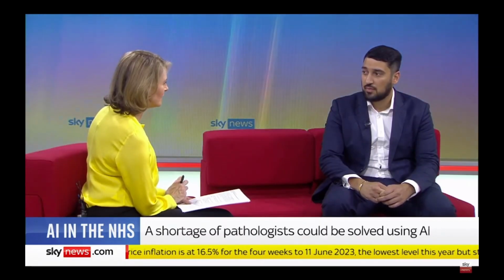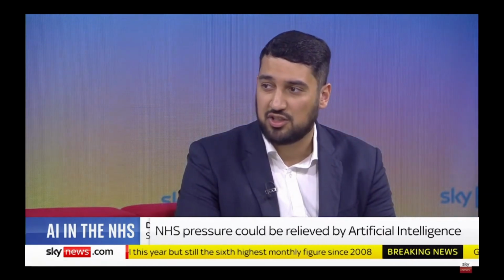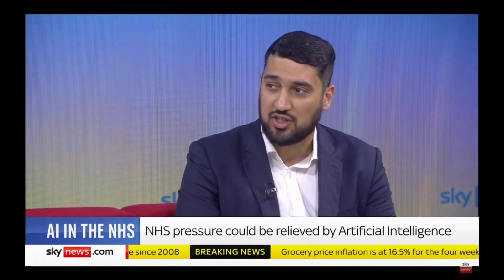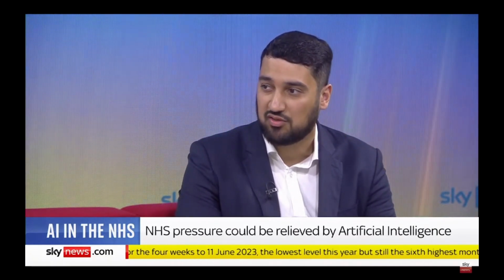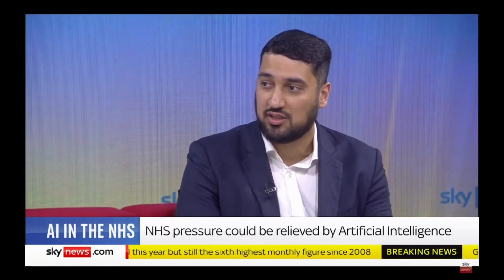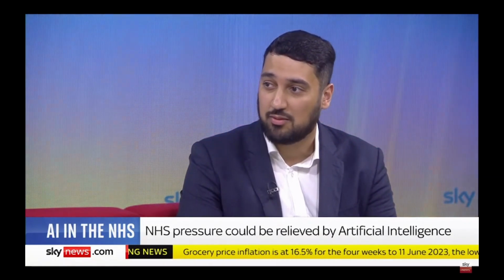I mean, it sounds costly though. How expensive would this be, and is this for the NHS? So I think the biggest problem is the infrastructure costs. So you'll need to get IT lines into the hospitals because each image is around 500 megabytes. You'll need cloud infrastructure, you'll need servers for archiving of images to come back to them in the future. And then you'll need communication between the various pieces of software that the NHS use. There's not one singular software that each hospital uses. So you'll need different laboratory information management systems, talking to imaging systems, talking to different AI providers. And so the costs will add up, but it is crucial because there is no alternative right now.